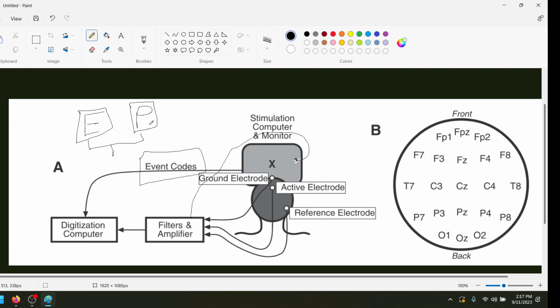Nobody does this. Some people do this, but not enough people do this. It's so easy. It's effortless essentially, and you don't even have to do it during the experiment. I do for my main experiments because I'm super paranoid. But what I find as a result is that my computers are very well behaving, so they don't ever drop frames and they don't have a lot of jitter. Jitter meaning the variation in when a frame is shown versus not.